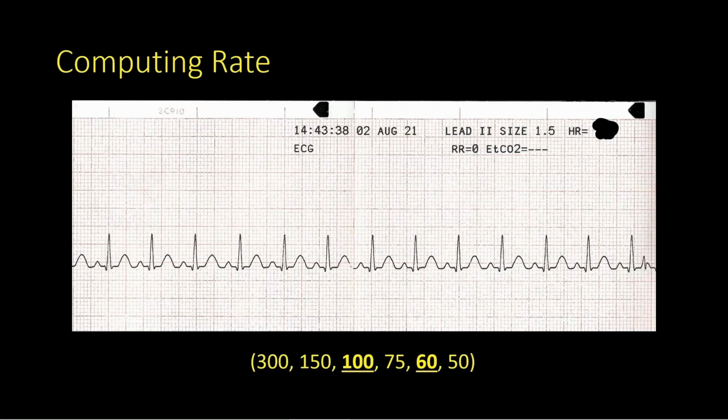Now, this strip looks a little bit more regular. They're fairly close together. And if we're going to do it based on a 6-second strip, we have 1 second here, 2, 3, 4, 5, 6. So from this point here, if we count all the way from here back to here, we've got 1, 2, 3, 4, 5, 6, 7, 8, 9, 10, 11, 12. Okay, so that would be about 120 if we multiply by 10.